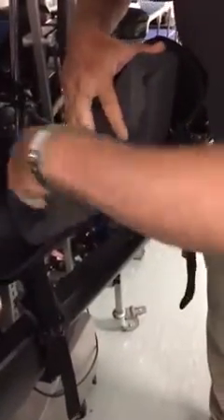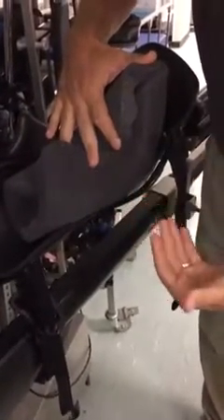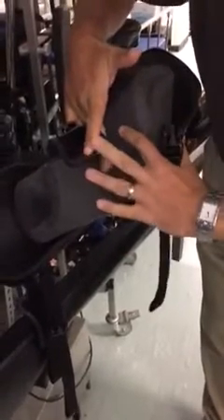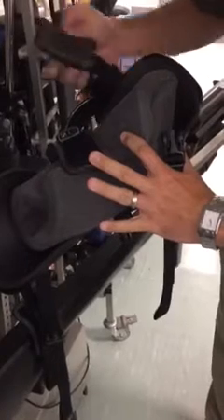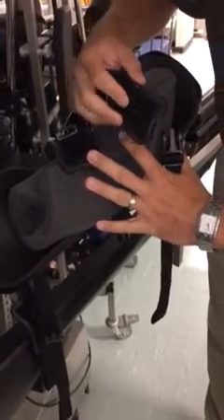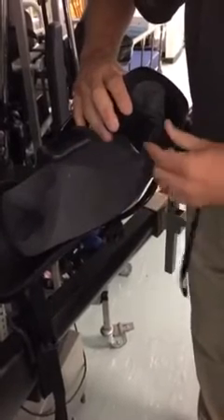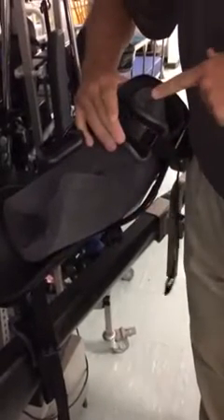Let me fold this over. Obviously you'd be co-banded around. The center one is going to be fine. This strap where it sits may be okay, but you still could be hitting the toes.